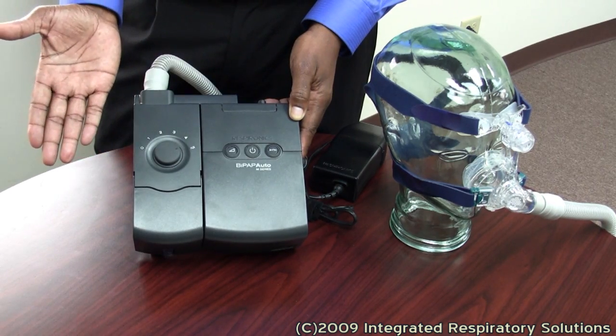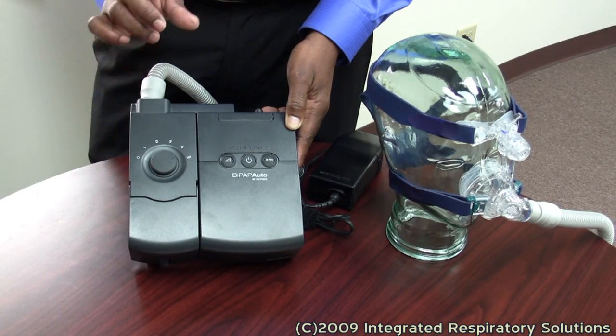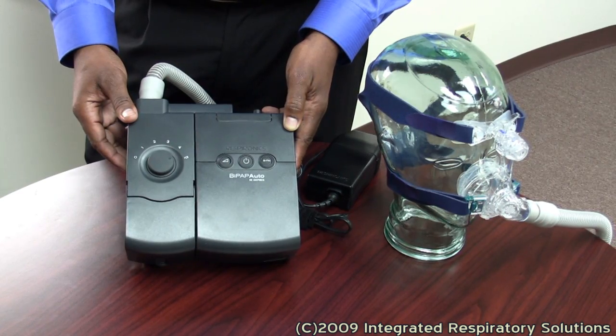This is a BiPAP device. Your doctor may order you one of these pieces of equipment based on the severity of your apnea or failure of a CPAP device.